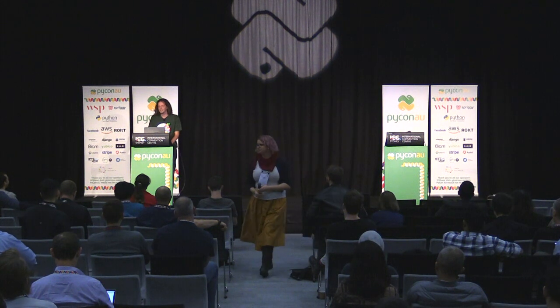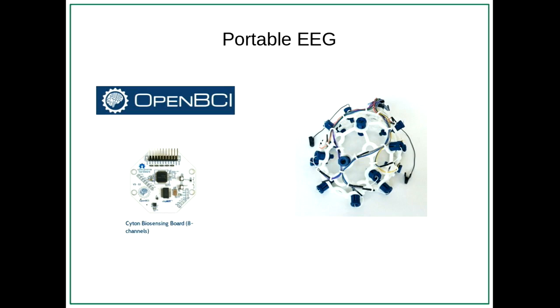Thank you. That's an excellent question. I also encountered this problem because the amplifier is the most expensive bit of equipment. For the rest, you just need a laptop. So I looked around, and there's this OpenBCI initiative. Oh, it's not there anymore. Anyway, these guys make affordable BCI systems that also support Lab Streaming Layer. So I actually ordered two of those, and with that I try to more or less deploy neurofeedback myself as well.